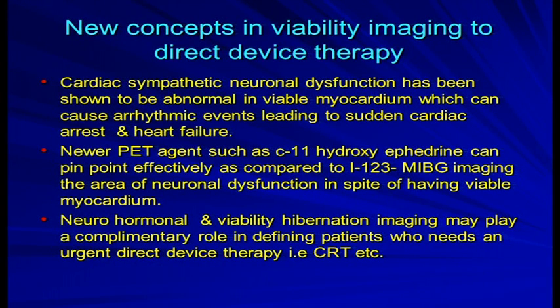So what is the new concept in viability imaging to direct device therapy? Cardiac sympathetic neuronal dysfunction has been shown to be abnormal in viable myocardium, which can cause arrhythmic events leading to sudden cardiac death and heart failure.